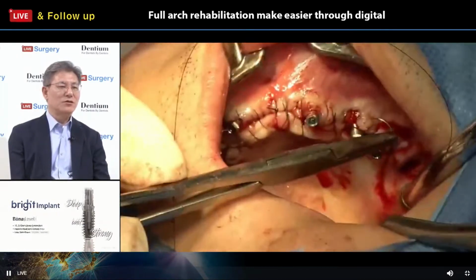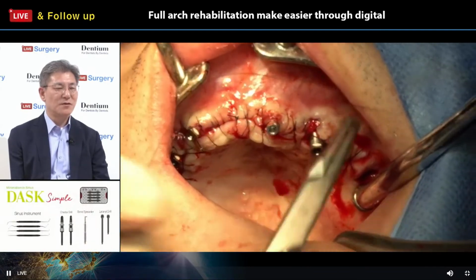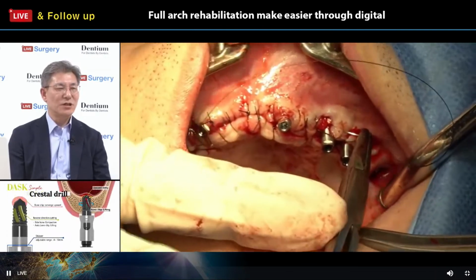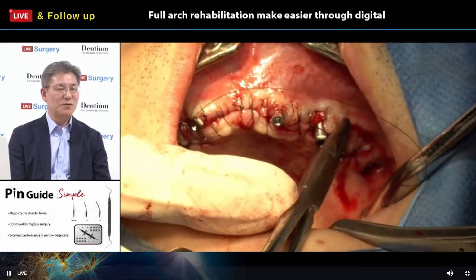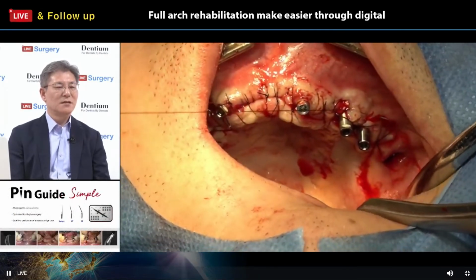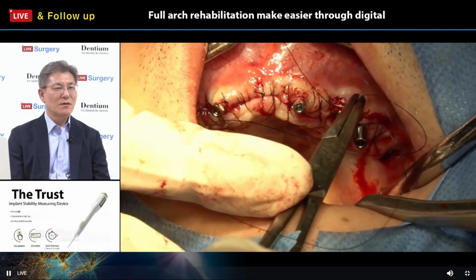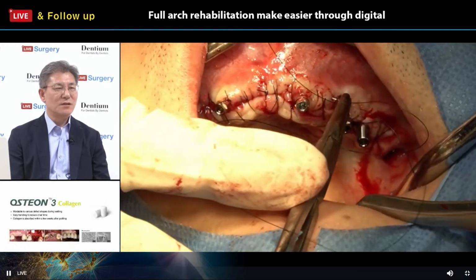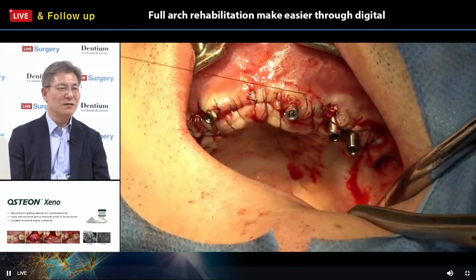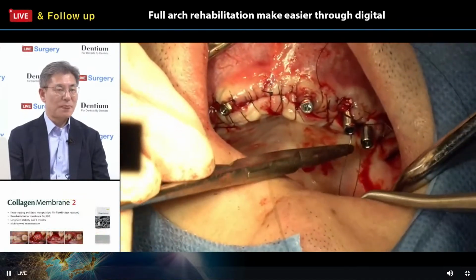According to the achieved information, we make the PMMA prosthesis for the temporization with the proper vertical height and proper positioning, with the proper midline, the proper occlusal plane, and the proper shape. All of these important factors are achieved in an easier manner due to the digital procedure.